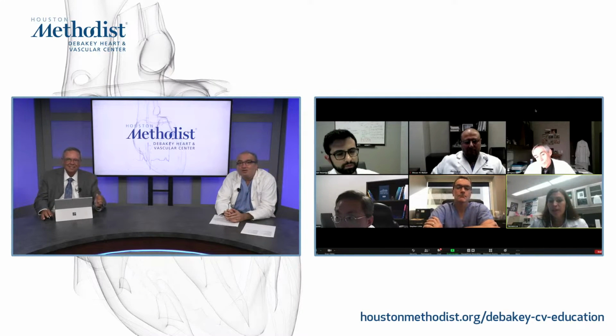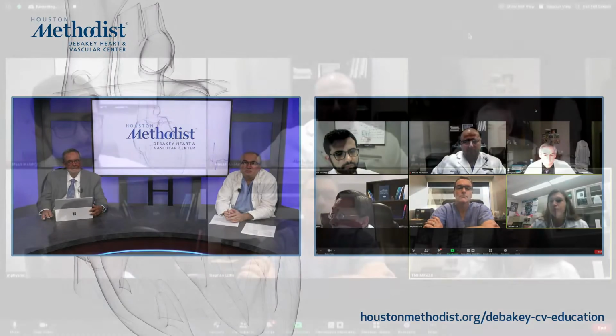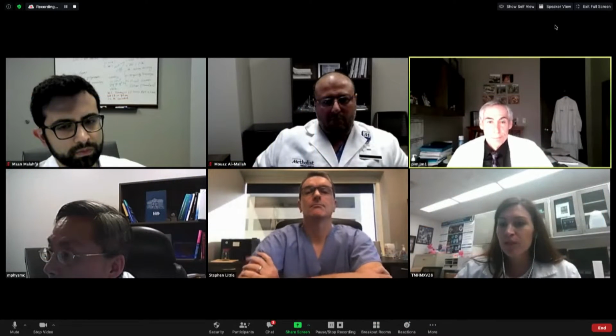So doing the echo is really quick. It can be from 20 minutes to maybe an hour, depending on the quality of the imaging of the echo. Using the CT imaging is a little bit longer, but it also provides more complete data in a way, because we can isolate the ventricle, we can extract the atrium and the aorta and the chordae. So for the CT-based modeling, we do need maybe 3 to 4 hours, but it depends, of course, on the complexity of the model itself and what we want to achieve.